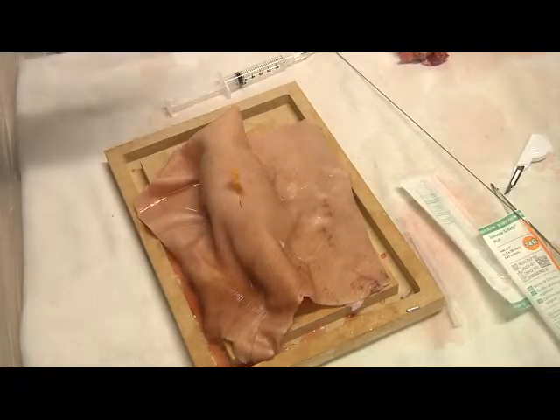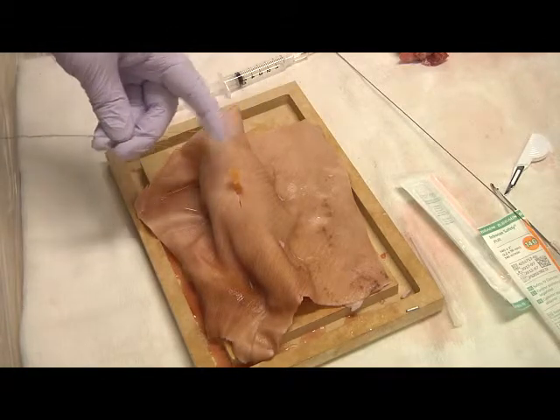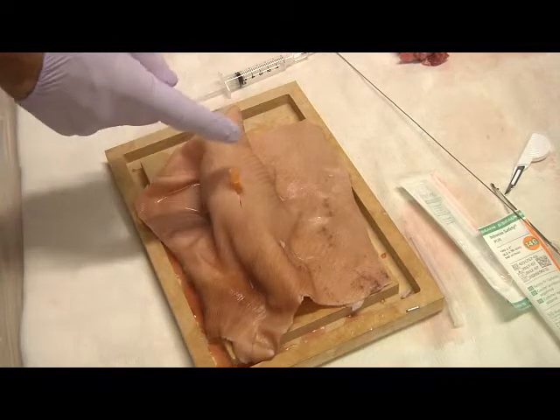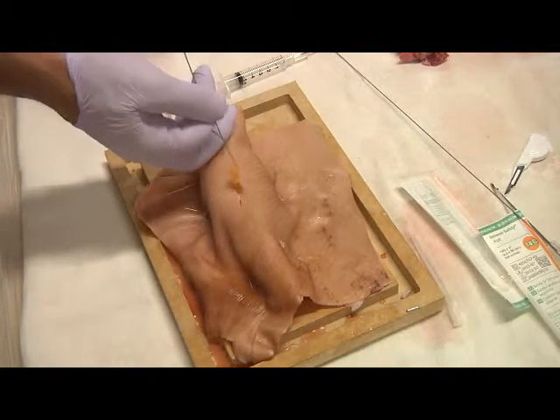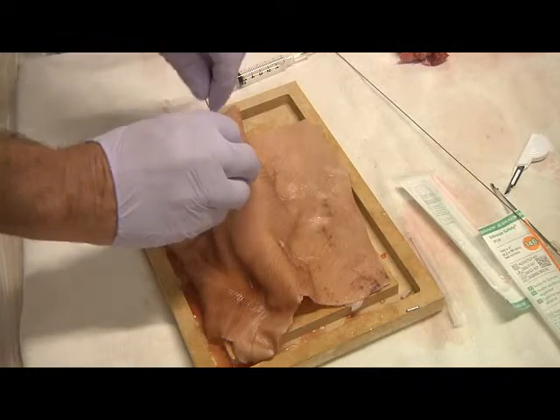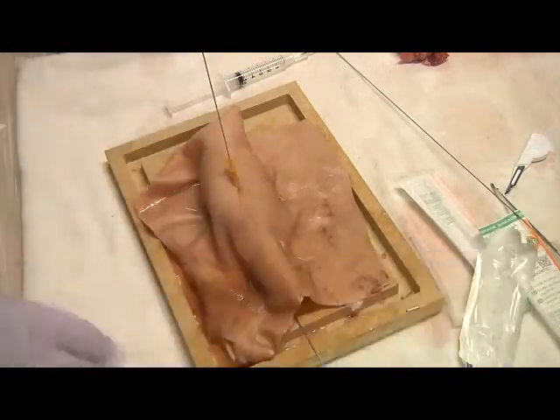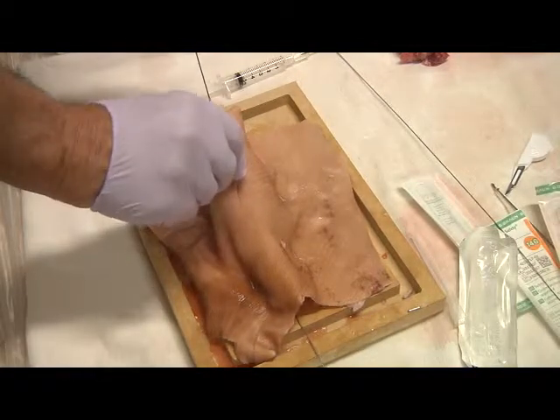So once you're in, you're going to take the wire. Now the wire has two ends. It has a stiff end, you can imagine would puncture the mucosa, right? And you have a floppy end. So it's not a J wire. The floppy end goes in, and it should go reasonably smoothly. Yeah, there it goes. You may see it come out the trachea. Right. I said we stuck on something. And once you have it in, you can take out the catheter.